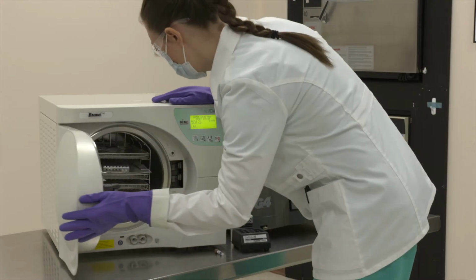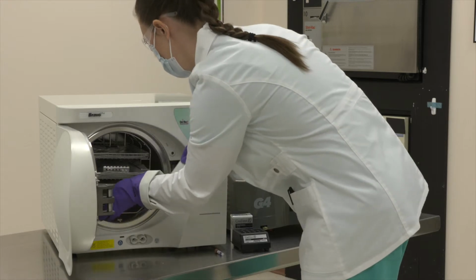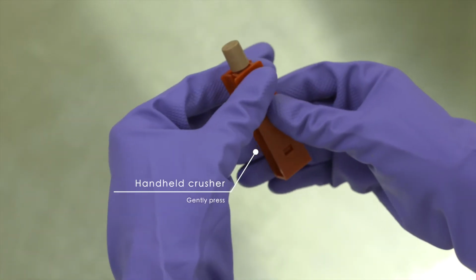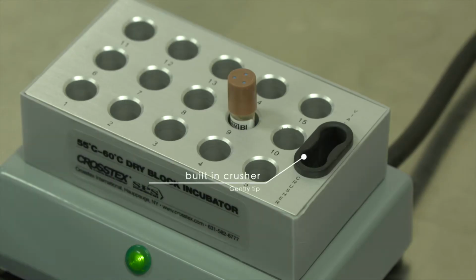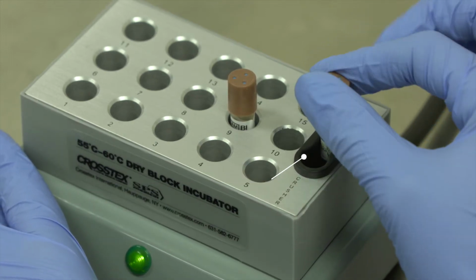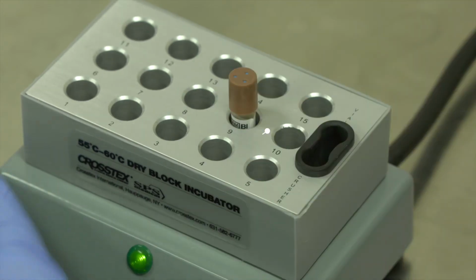After the SCBIs have been processed in a sterilizer and allowed to cool, each unit must be activated by crushing the inner vial. This can be accomplished by pressing the vials towards each other or through the use of a crushing tool. If your incubator has a built-in vial crusher, simply place the vial vertically into the opening and gently tip the SCBI to the side. In most cases, an audible pop can be heard when the media ampule breaks.